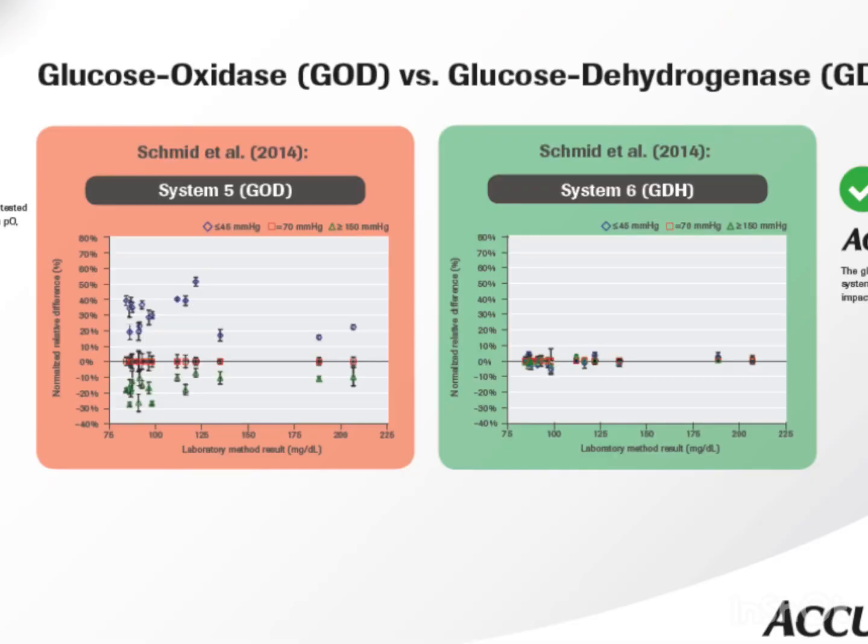Again, it is very important to look out for accuracy when it comes to a blood glucose monitoring system, because doctors and healthcare practitioners use these blood glucose monitoring systems to diagnose you and help give you a better recommendation. And so if your blood glucose monitoring system is not certain on accuracy, it might bring you a lot of harm.